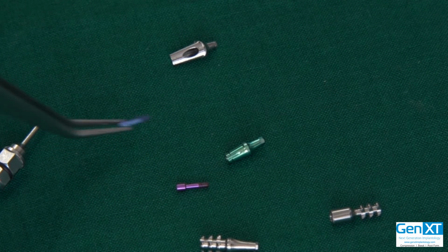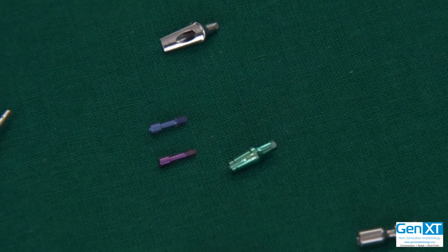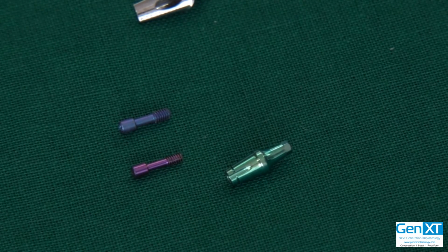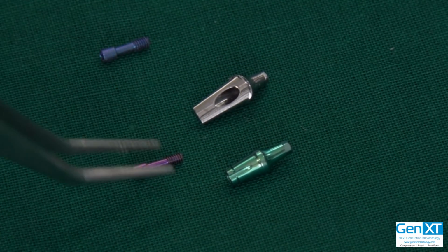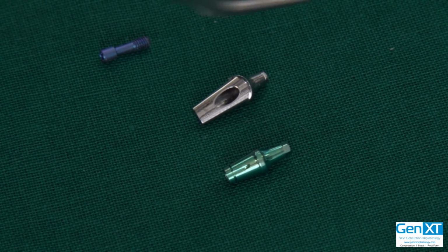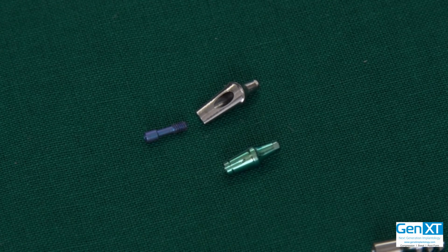All abutments will come with a clinical screw, and you can use your old screw as a lab screw. There are some studies about the way labs use the screws, they may deform them or damage the threading, which may eventually compromise the capability of the screw. So you get two screws. What you buy with the abutment, you keep with you, and what you receive initially is what you send to the lab. If they are misusing it in some way, when the job comes back, you just put that screw away. You can use the clinical screw and go ahead and tighten the abutment.